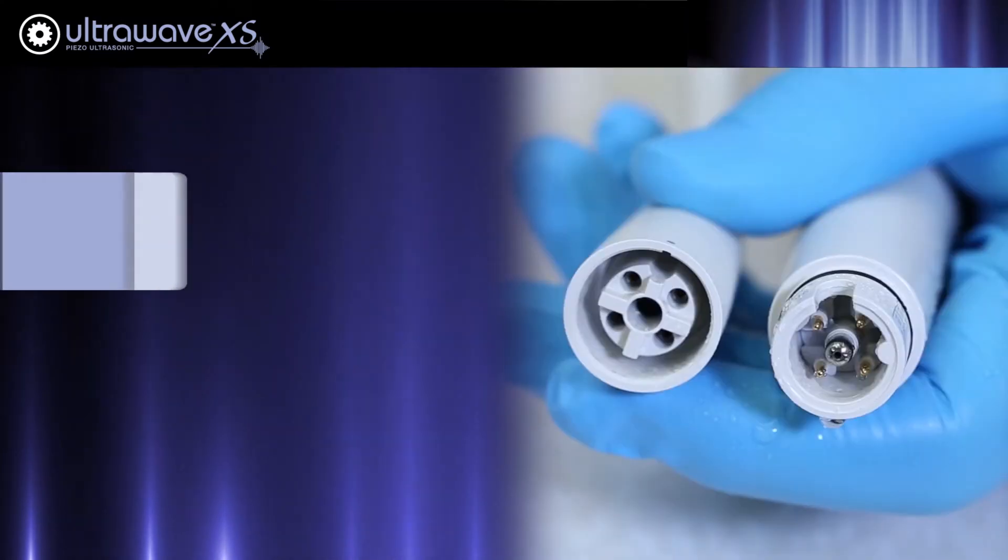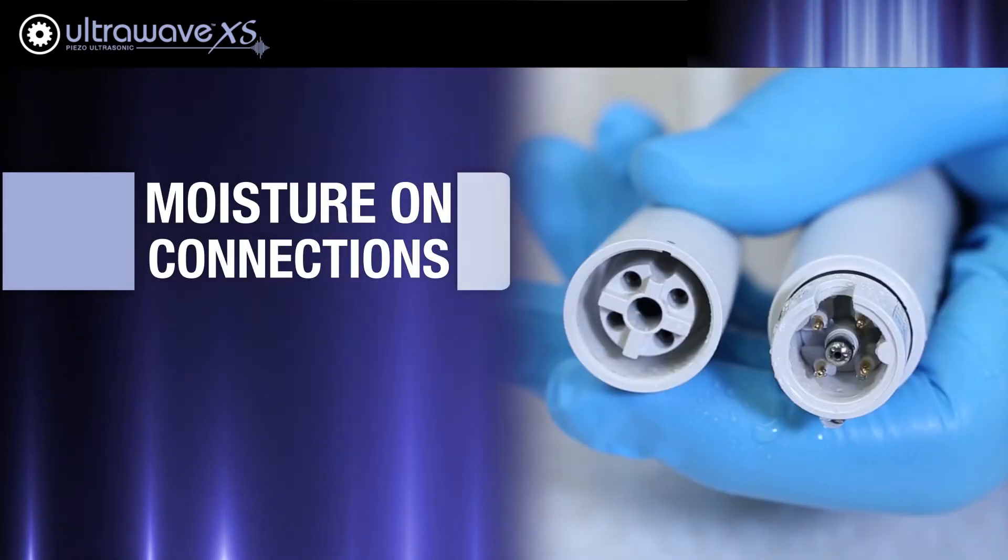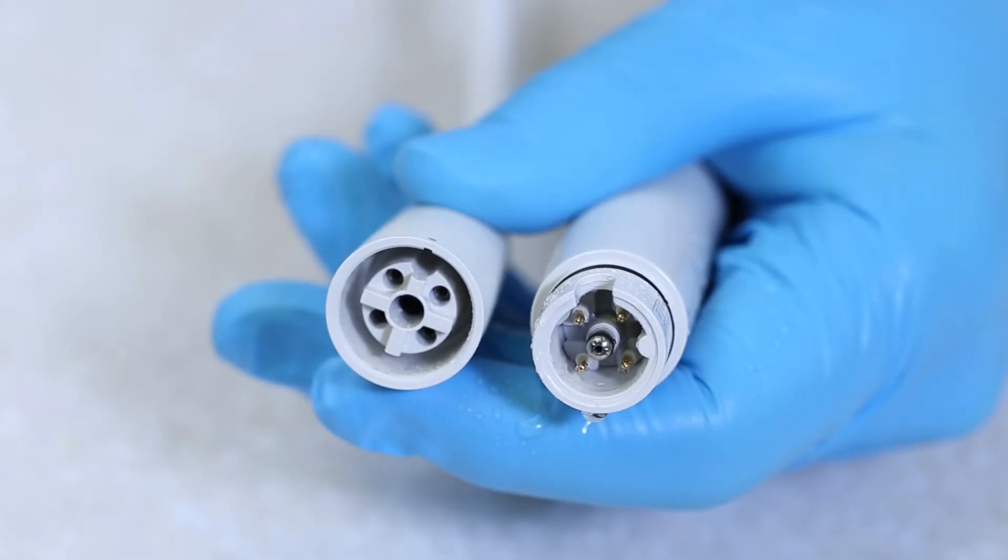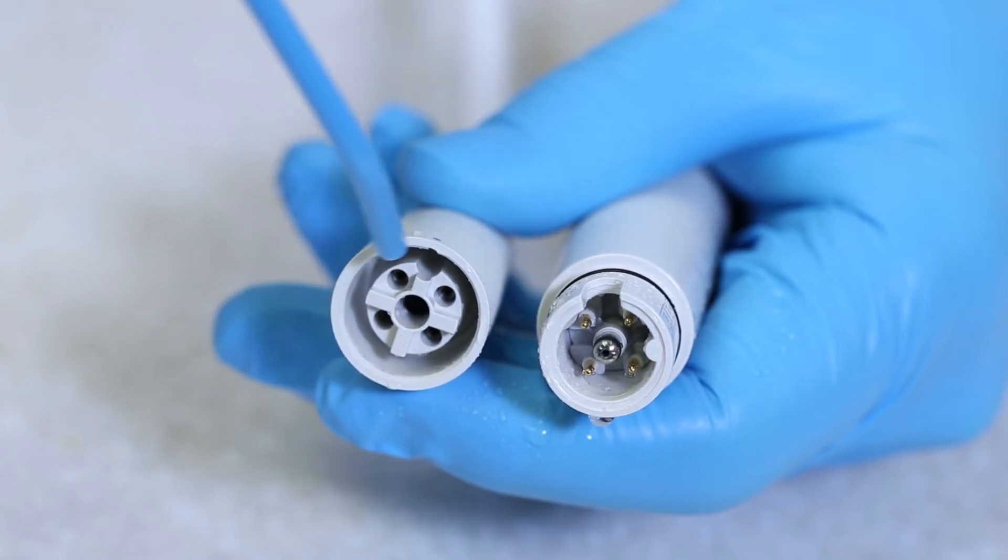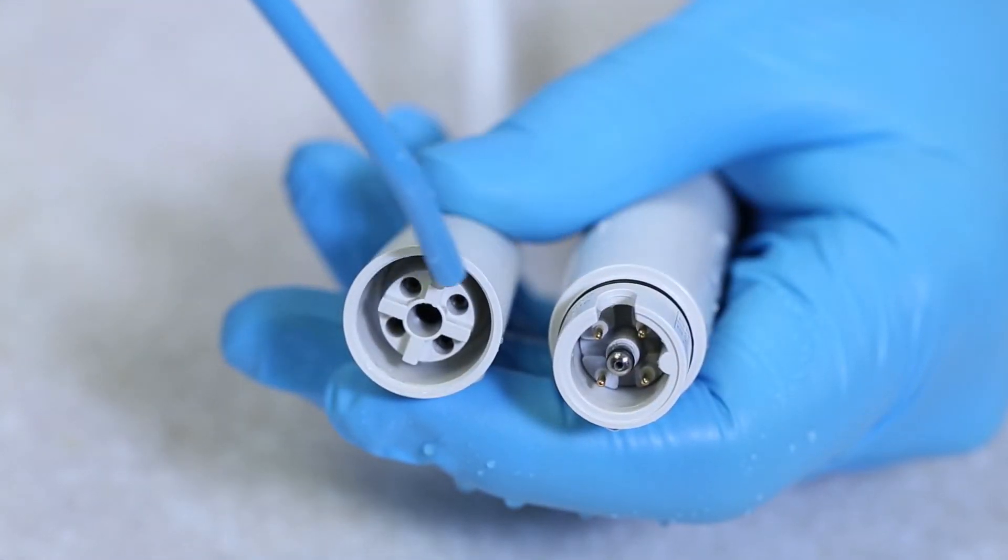If you are using the correct tip and it is not worn down, the problem may be that moisture has gotten on the connections between the handpiece and the cord. If this is the case, thoroughly dry the connections until all moisture is gone.